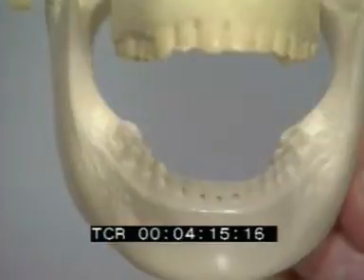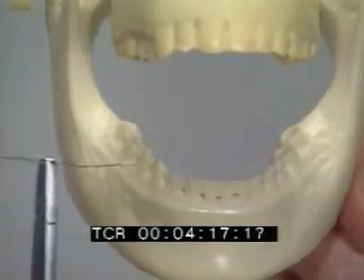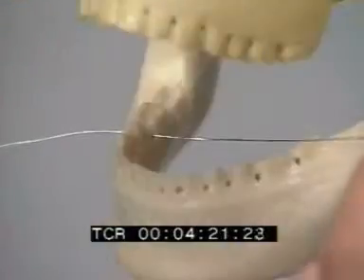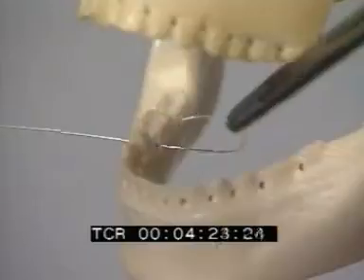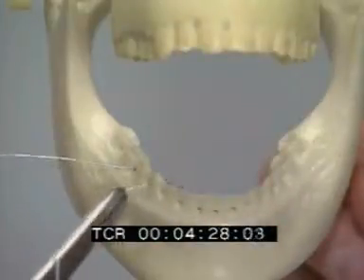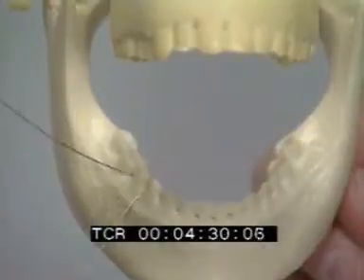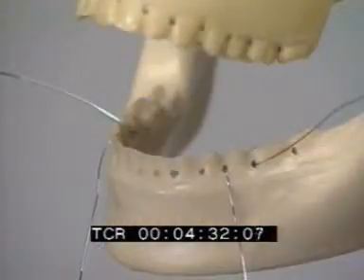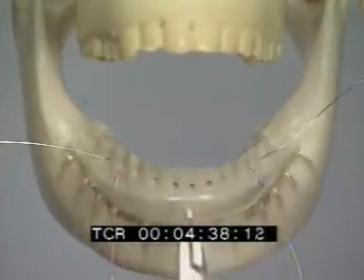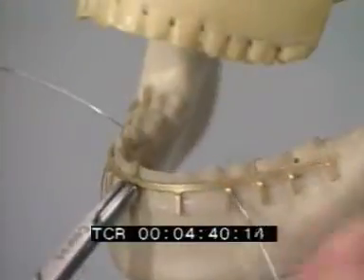To fix the arch bar in place, a ligature in the premolar region of each side is first prepared. The wire ends should not damage the surrounding soft tissues. The arch bar is positioned and fixed using the wire twister.